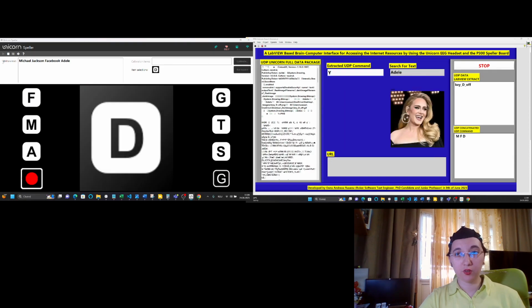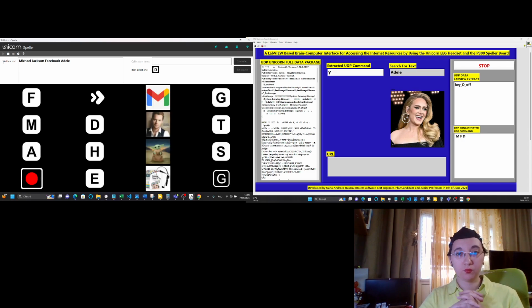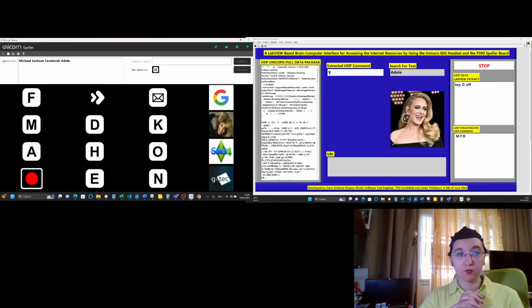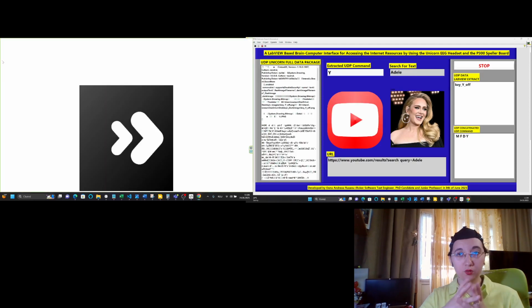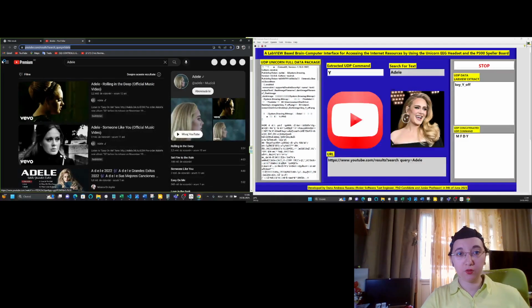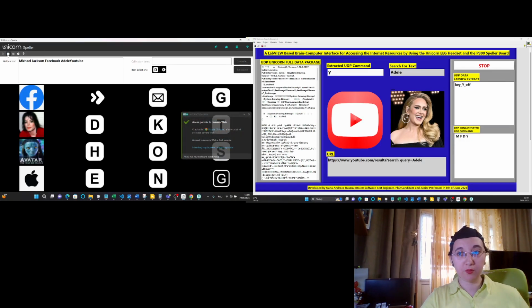So Adele is correctly selected. Now for YouTube. So YouTube is correctly selected. Now Google Chrome is opening the YouTube web page and we see the search option is set to Adele. Okay, stop for now.